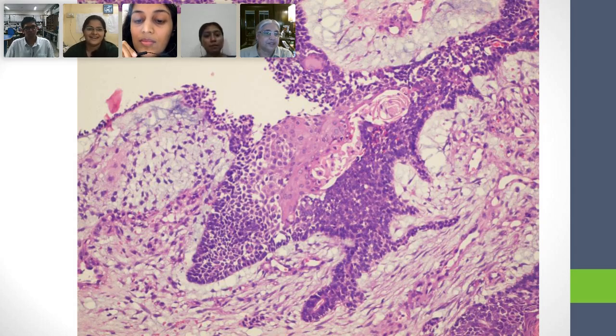Come, Kshitija. Never mind about the dysplasia. How are you going to describe this structure? It's a very irregular island of cells which have basaloid character, and it seems to have small palisading at the periphery. Very good. You can see that. And what is this palisade? Why did you say it was palisading?